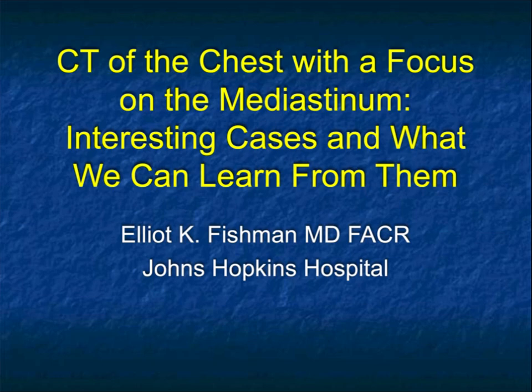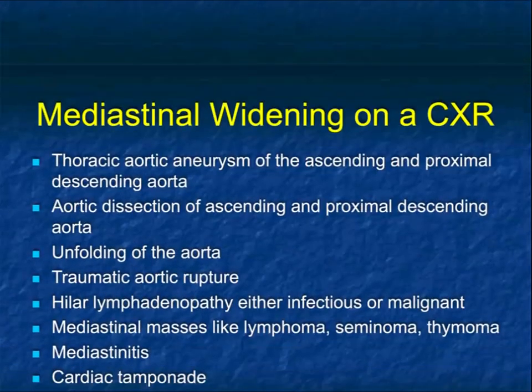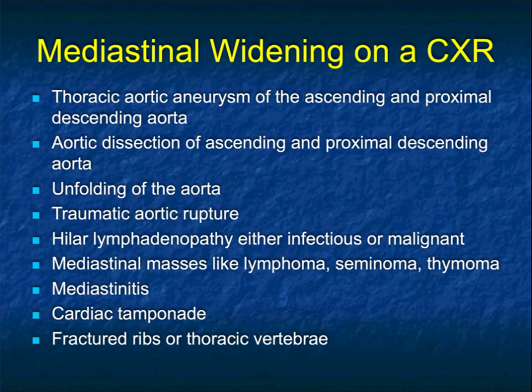What I'm going to look at in this talk is some of the work we end up with based on our Wednesday quiz conferences. These are some of the interesting cases I show the faculty, and I'd like to share them with you and make some teaching points. We recognize mediastinal widening on a chest x-ray is a very common finding. From chest x-ray, you go right to CT.